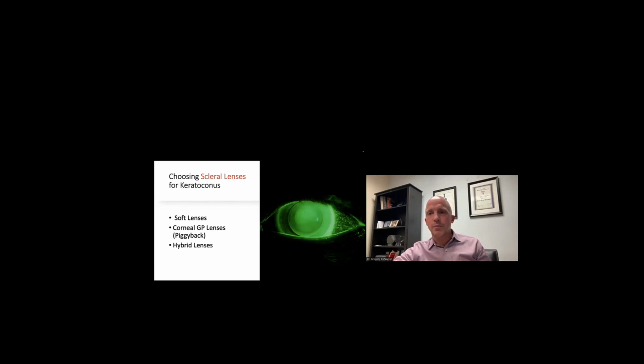I'm not really a hybrid lens fitter, but it is an option for patients with mild to moderate keratoconus. Probably not a great option for patients with more severe ectatic disease. And then finally, we're going to talk the rest of the webinar about using scleral contact lenses. In my office, scleral contact lenses are the default lens of choice for patients with moderate to severe ectatic keratoconus.